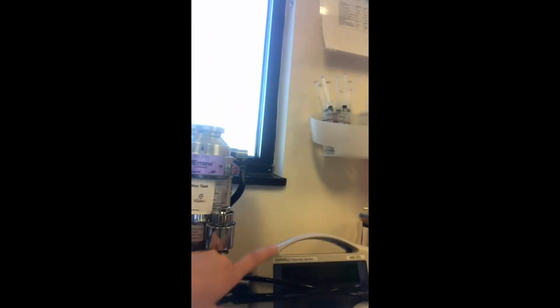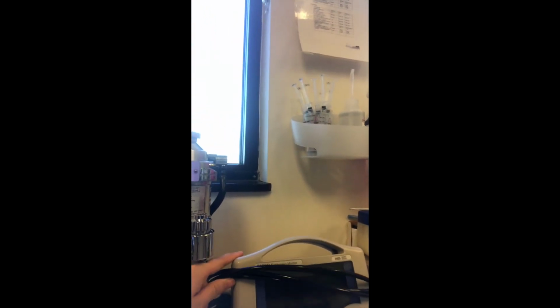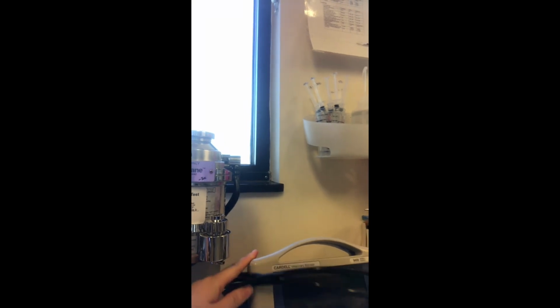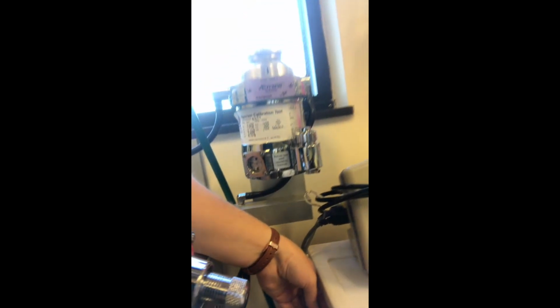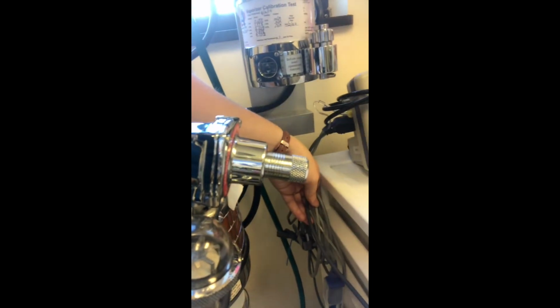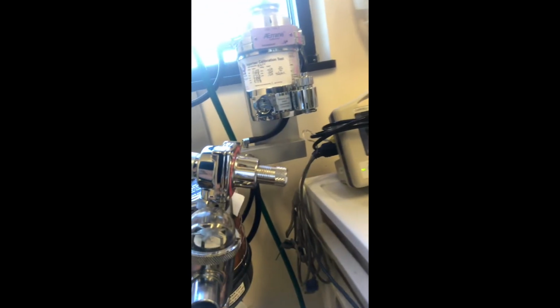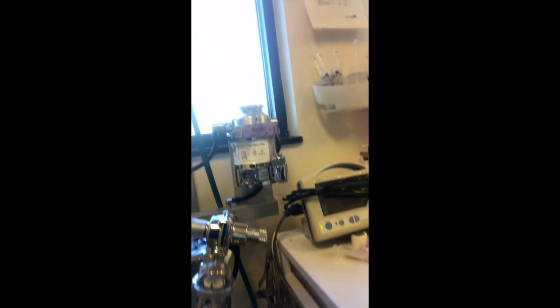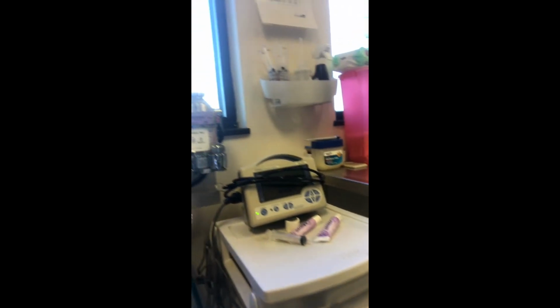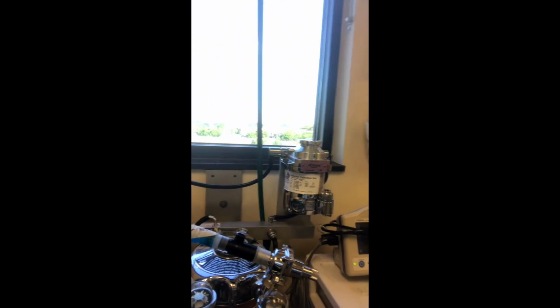We have our Cardell here that does our ECGs, all of our monitoring and things like that. Our SpO2 clip is down here, our ECG clips, and then our CO2. We also have our blood pressure cuffs that also connect there.